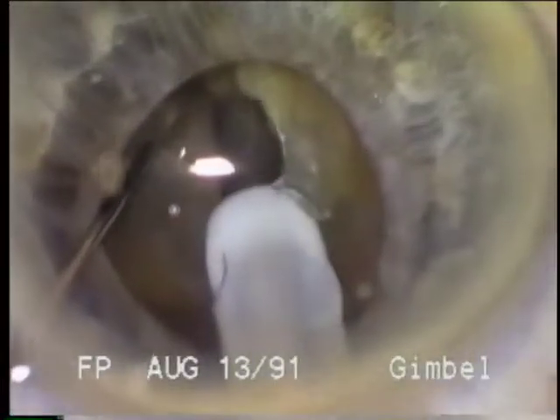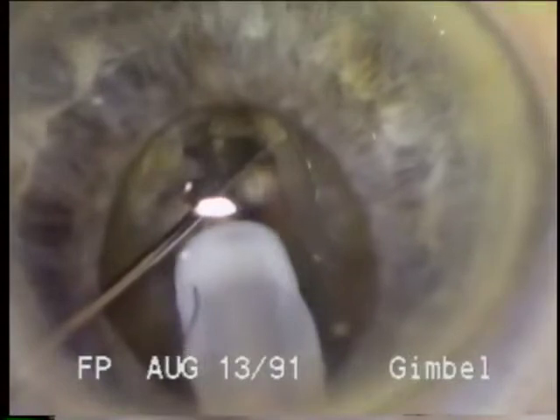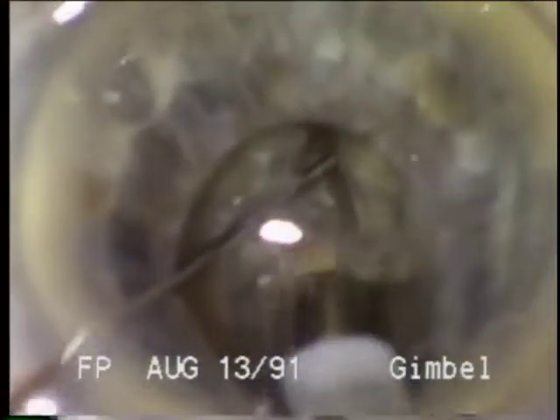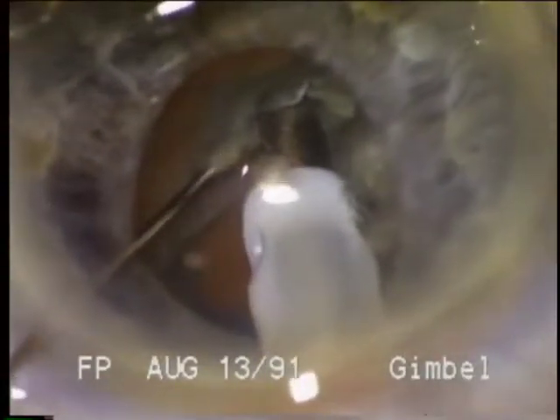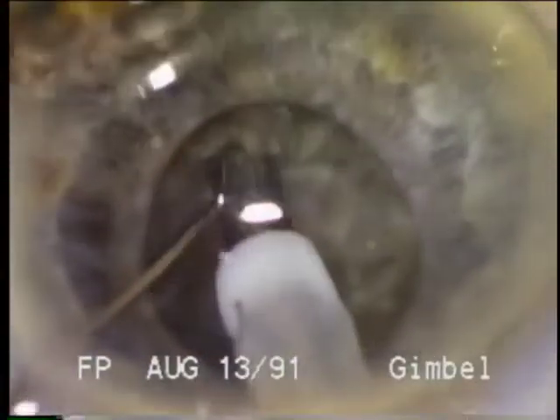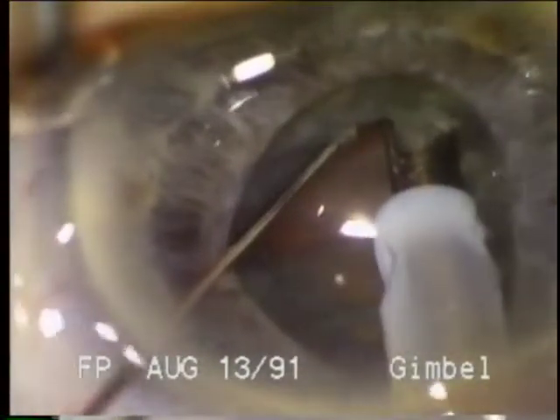If we nibble away the cortex and leave the posterior plate, that can present a real challenge as to how to get at that plate. But if we can fracture through it, while we still have adequate peripheral nuclear material, then we don't have the challenge at the end of trying to get under that plate or shaving it thin enough to emulsify.